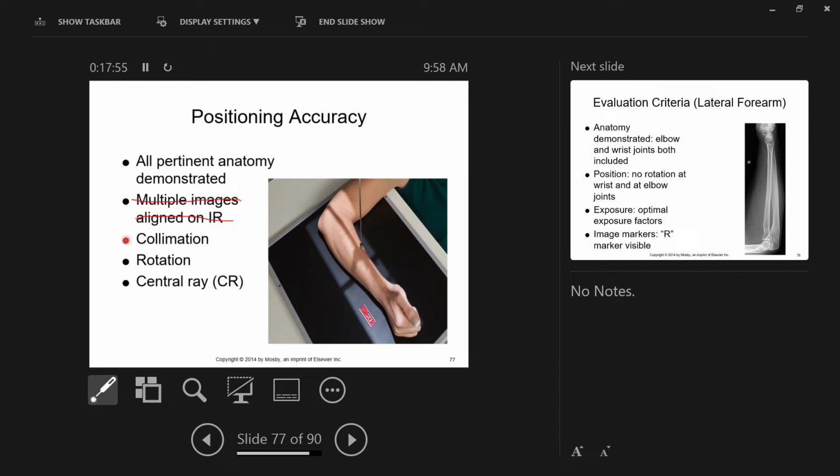Not the projection. What is the X-ray tube making? An X-ray beam, right? You're right. So it's photons, right? So it's a big stream of X-rays, and we need to change the size of what we would call our radiation field. Okay. So collimation is changing the size of your radiation field underneath the X-ray tube.